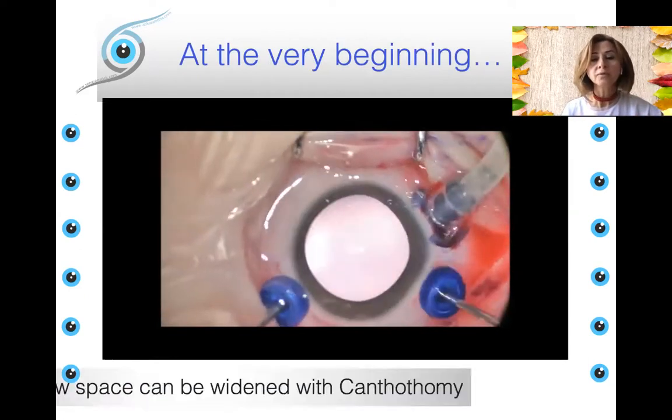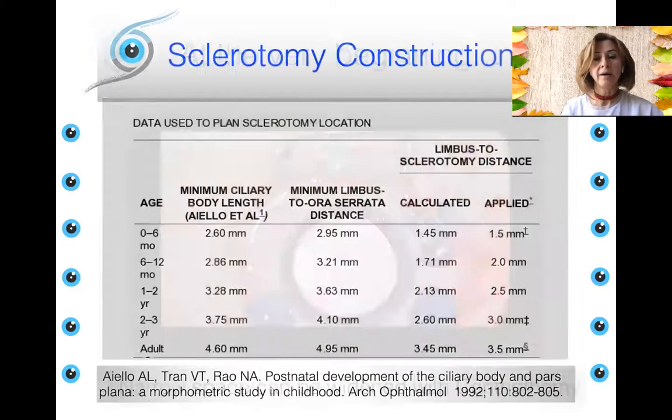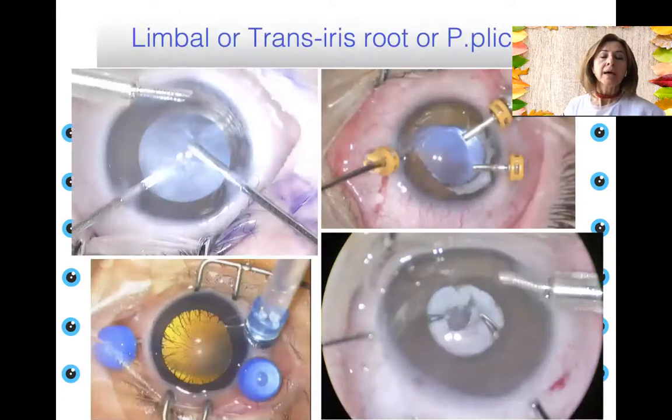This can be widened with a small canthotomy so that you have enough space to move the eye. Sclerotomy construction is one of the important steps of this surgery. We start with 1.5 millimeters from the limbus, and until 3 years of age, we increase a little bit from the limbus every year. We can do either limbal or trans-iris root entry if we are planning to do a lensectomy. But of course, if we are planning to do a lens-sparing vitrectomy, pars plicata entry is much better. You see, without trocars, with trocars, limbal entry, and these are pars plicata entries with trocars.